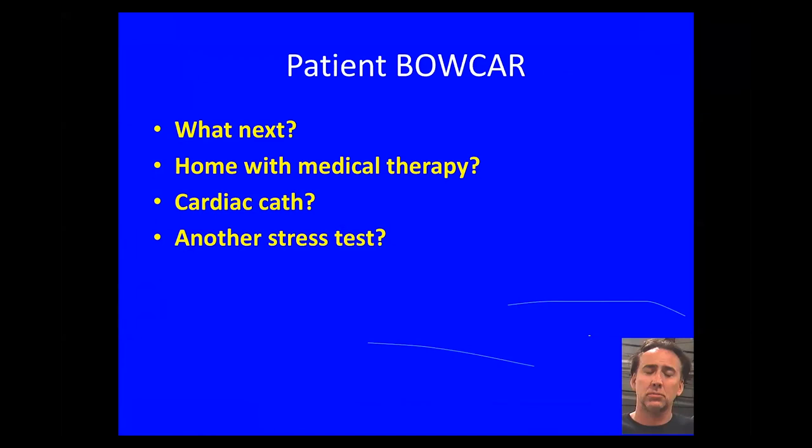So I think you have diffuse decrease in myocardial blood flow and abnormal ejection fraction. So this is not a low risk study, and there's coronary calcium too. Based on the fact that maybe the history is also limited with this patient with schizophrenia, I would probably cath the patient. Yeah, you're right.